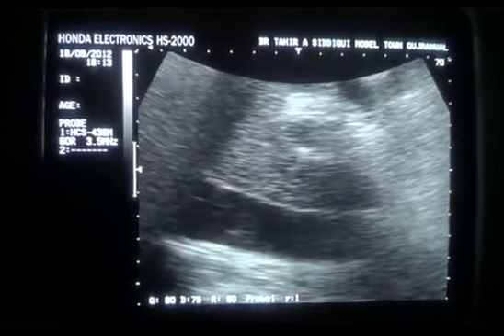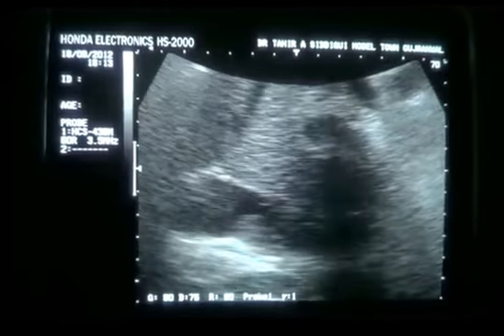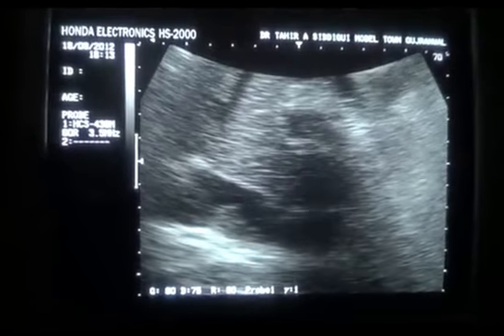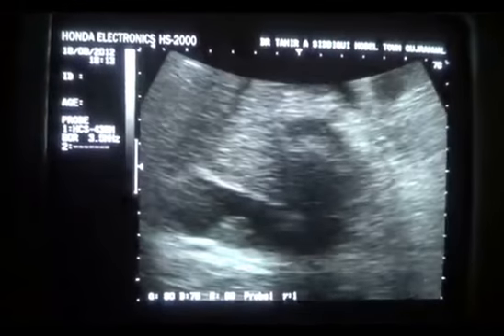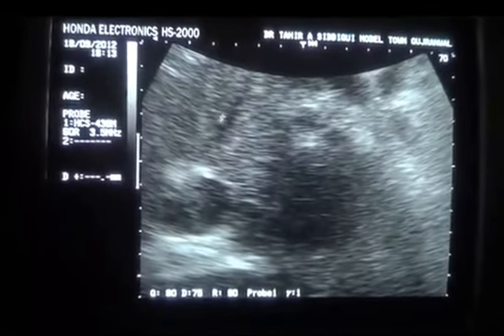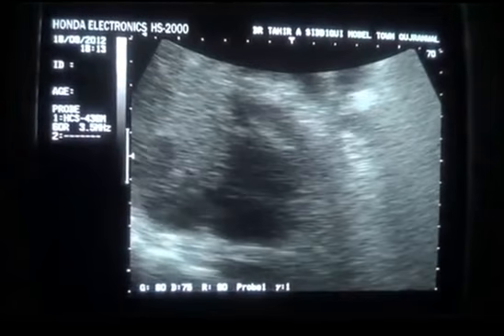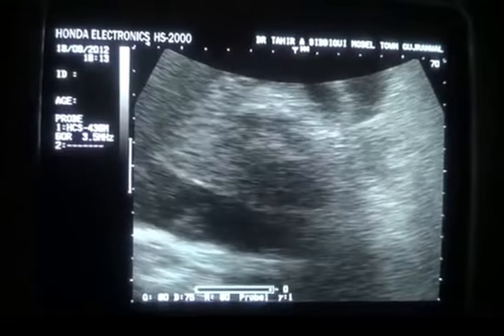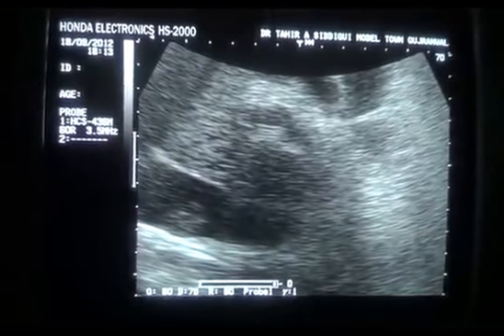This is a magnified view to show you why it is really the IVC. See the curve. This is a typical curve of the IVC, and secondly, you will see that this left hepatic vein will be entering the IVC. So there is a clot formation within the IVC in this section of the study.